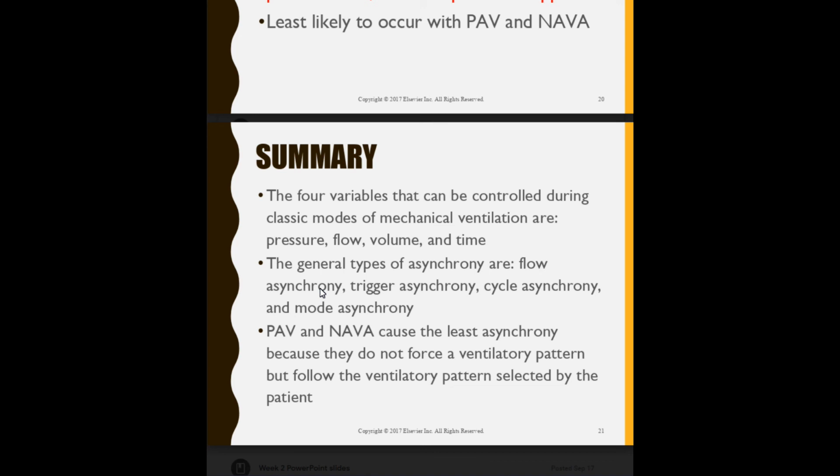So you don't see those as modes on a ventilator, and they're saying it's a type of ventilation, and so I think those are mostly for neurological patients and possibly in ICU, CCU. You might see something like that.